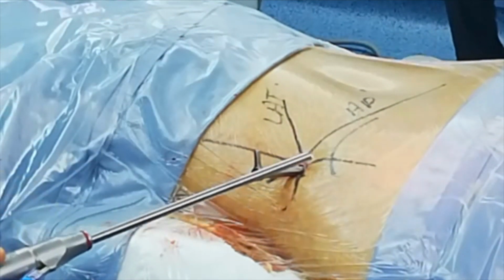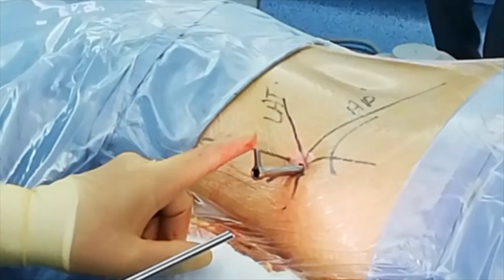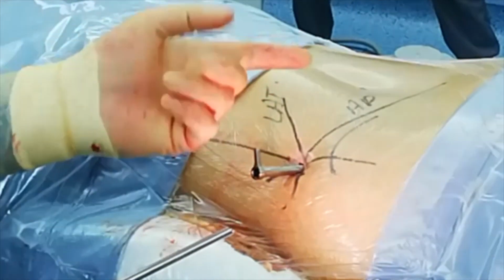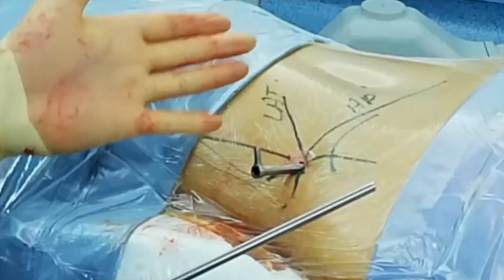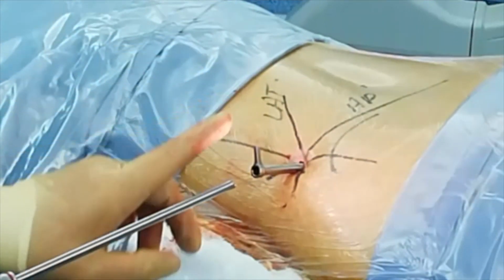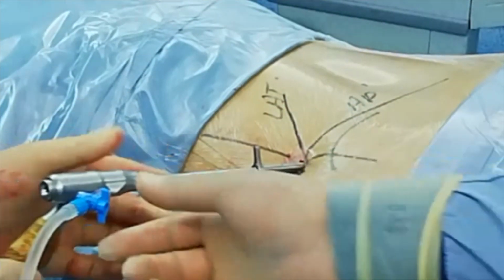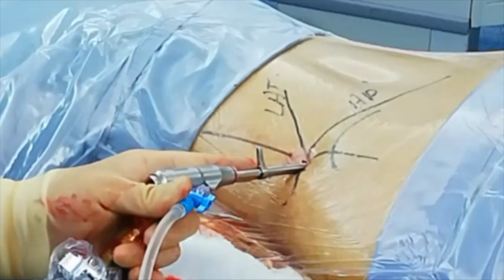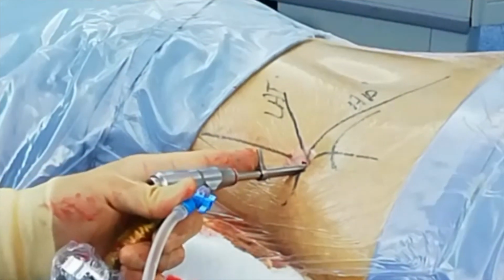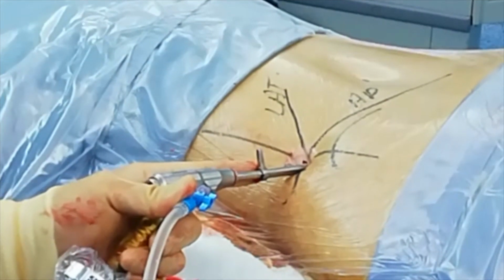And remember, this is the Thessys endoscope. It has a 30 degrees forward angle. So basically, the knob of the cannula is looking up, so the opening of the cannula is looking up towards the facet. So the first thing I really should see with this angulation, and that's the way we hold the endoscope, is actually, okay, water, just a bit of wash here, and this is how you hold the transforaminal endoscope when the patient is in the prone position.